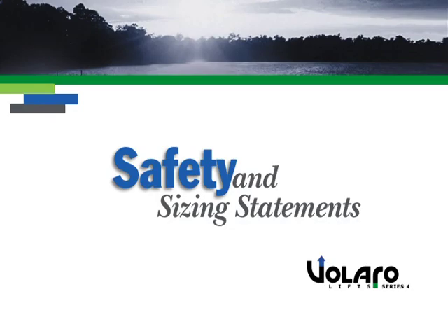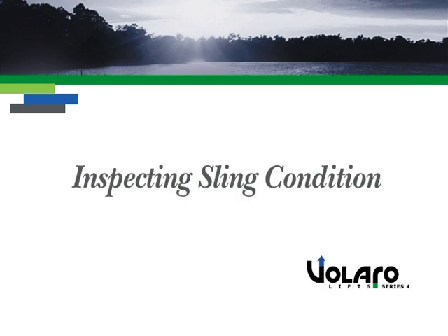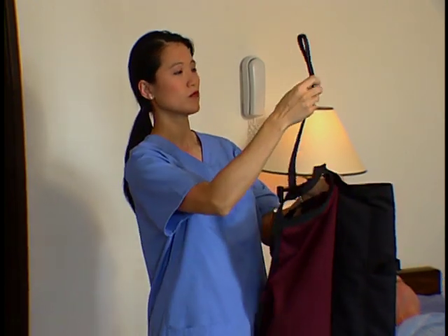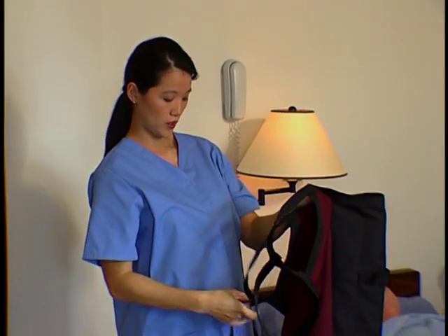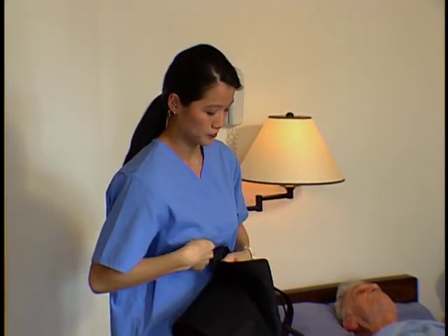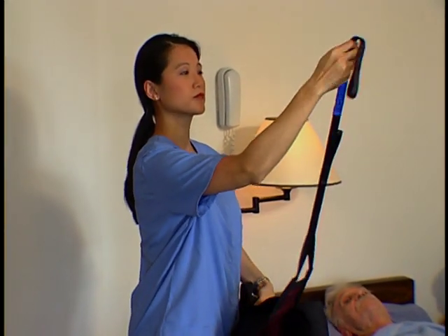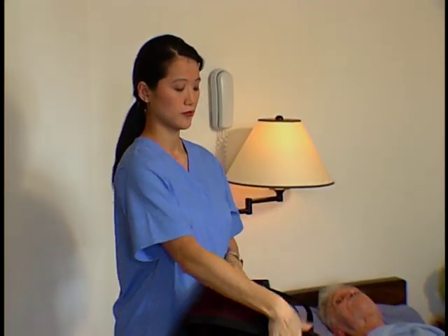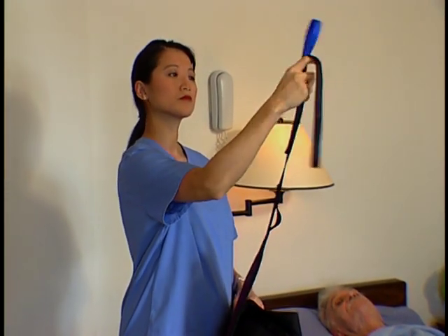Safety and sizing statements. Inspecting sling condition. You are responsible for the safe operation of your slings and accessories. Before each use, always inspect the sling material and any loops, strapping, or other components. If any of these items have cuts, tears, fraying, or loose seams, the item should not be used, but instead replaced with a different sling before proceeding.